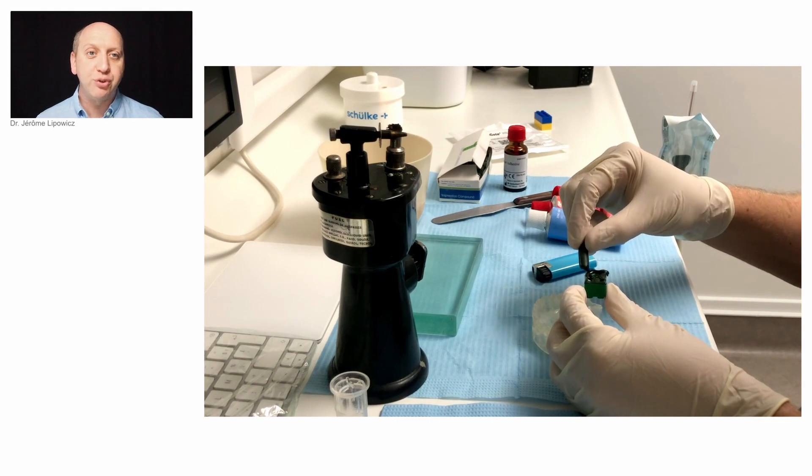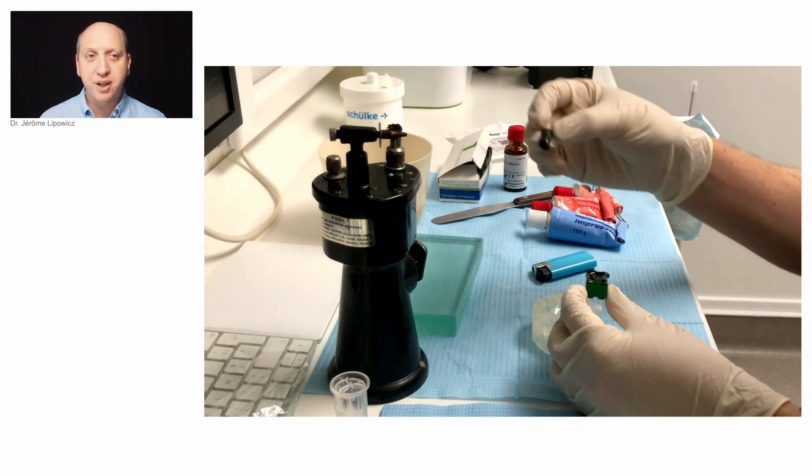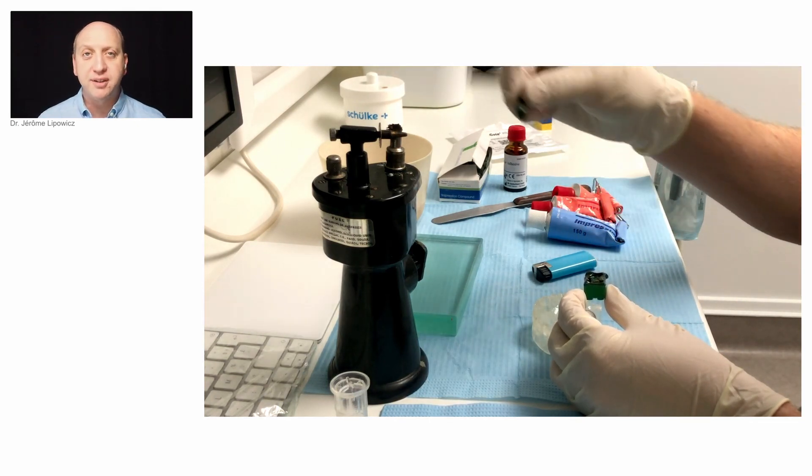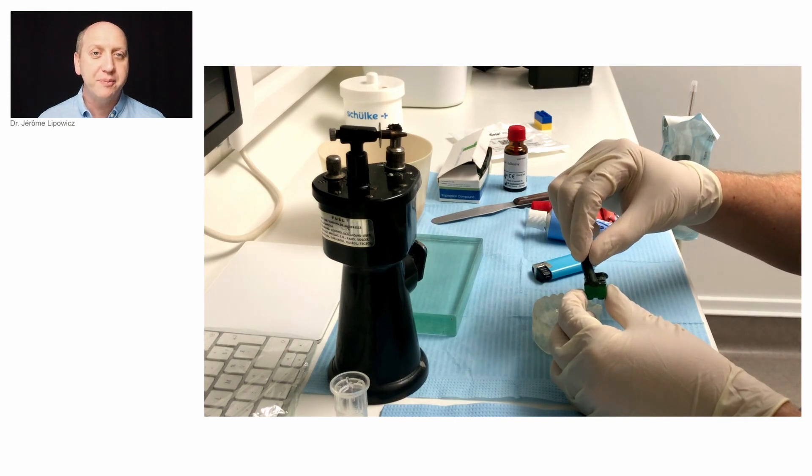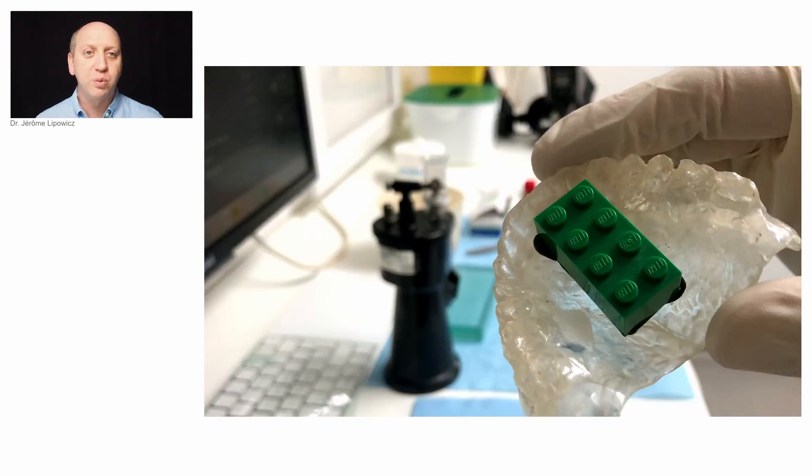The first step is to glue a big Lego brick on the duplicate without interfering with the denture. Just like this, with the good old impression compound. I know it's not really digital.